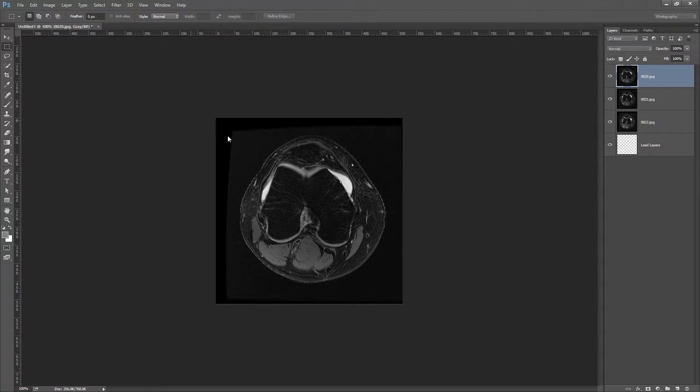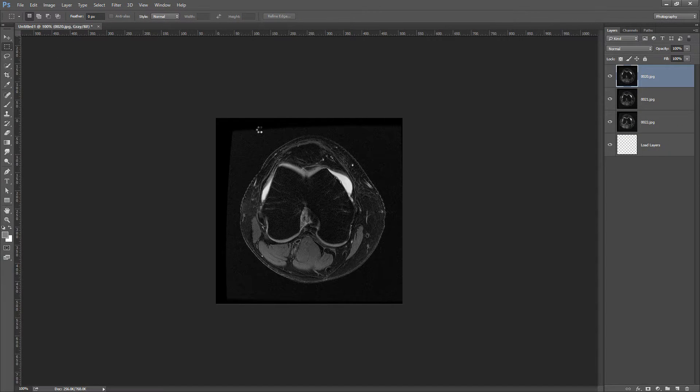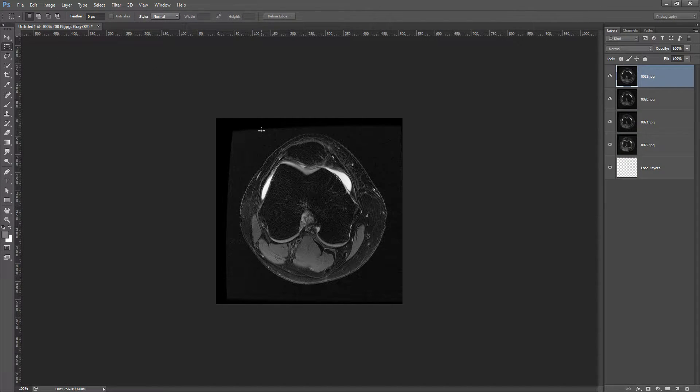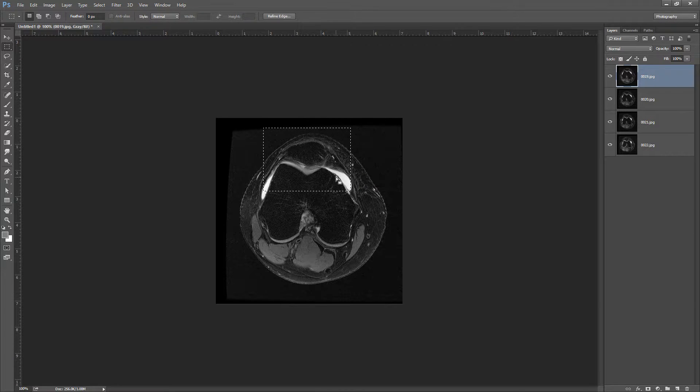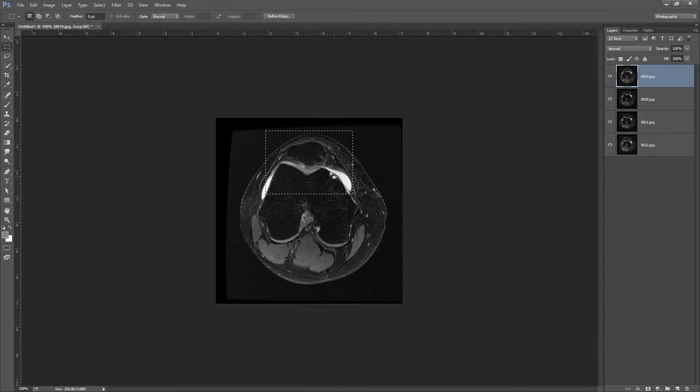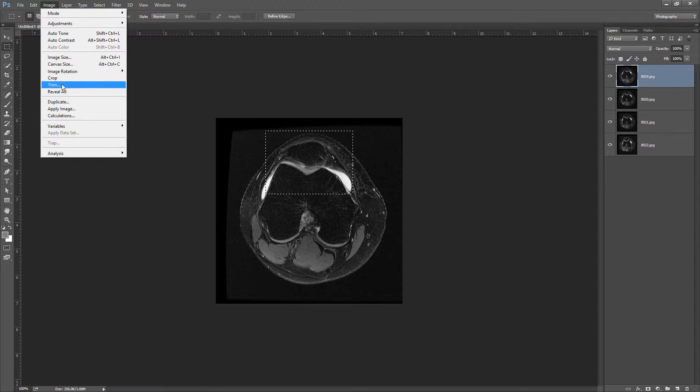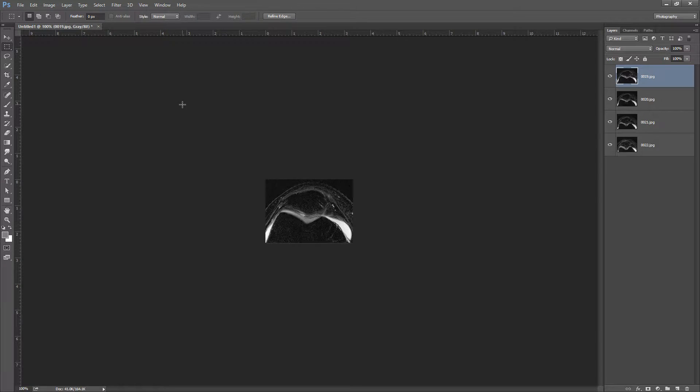I'm going to grab my Marquee tool and select the area I want to crop to once it finishes loading these. Then Image, Crop.